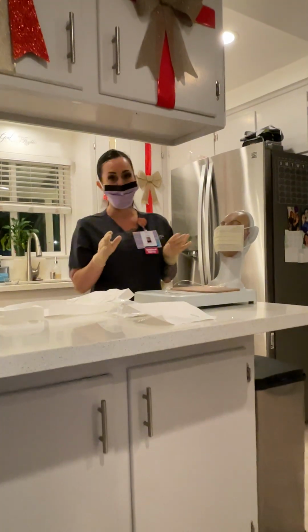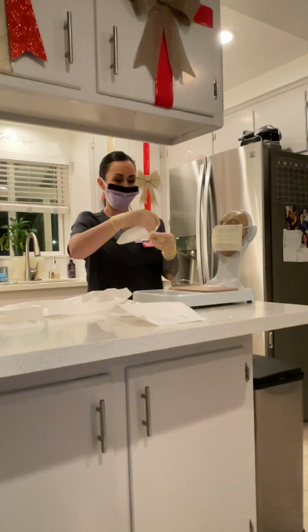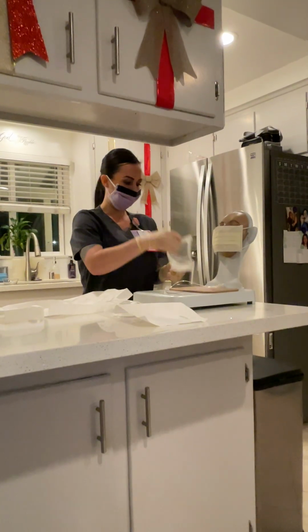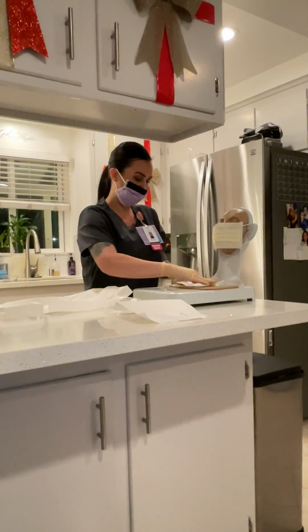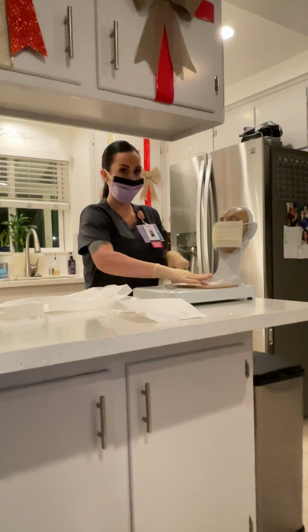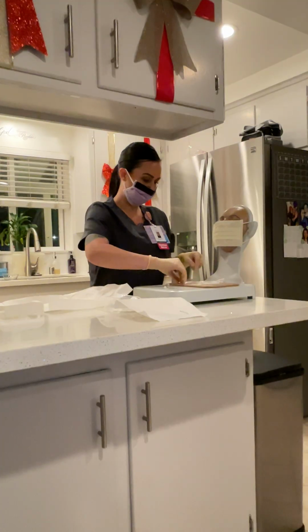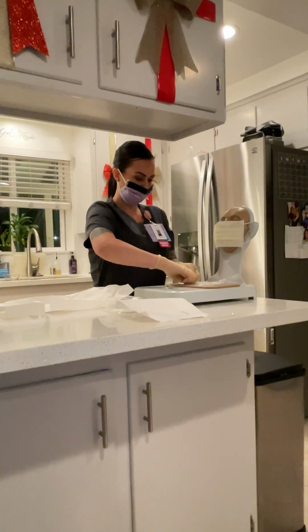From there, we are going to grab our new dressing. And we're going to want to place it over our insertion site. We want to make sure that there are no wrinkles. You don't want to have any bubbles in that, just as best as we can. Then we're going to want to remove the border.